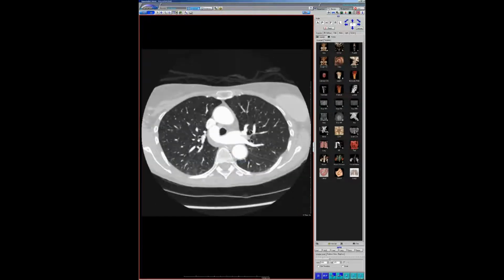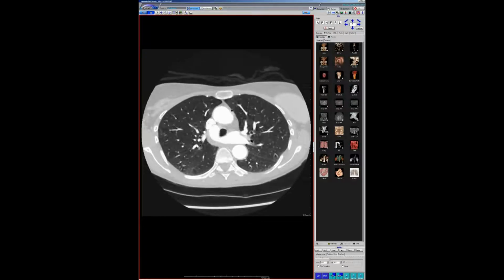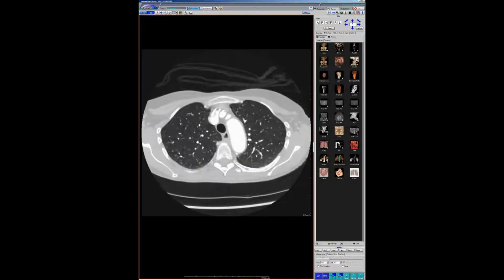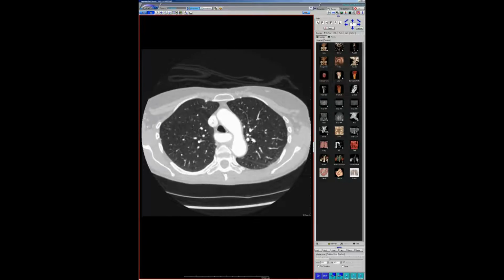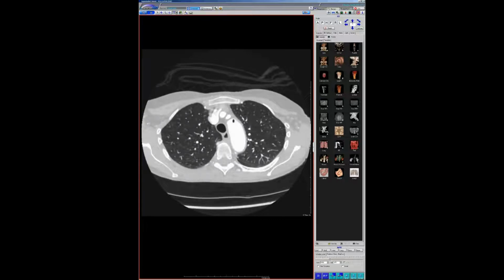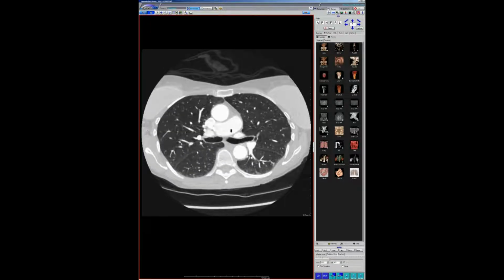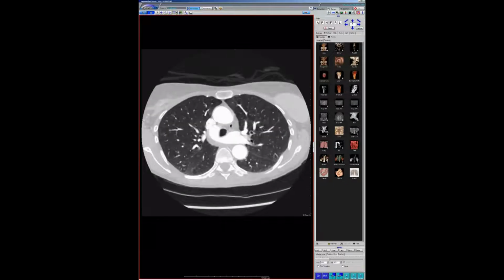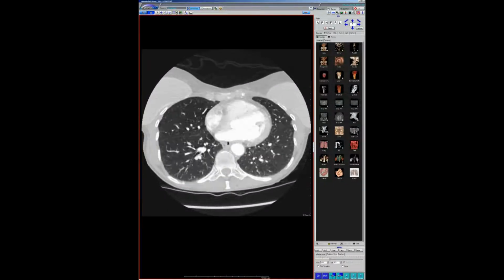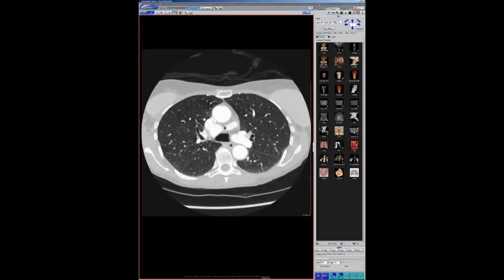Complete tracheal rings. I mean, given that it's older, probably not. But the airway definitely looks narrower. Yeah, I mean it's definitely compressed in the ring. But when you say airway, so there's right upper lobe. Well, they either get nothing, or they can get complete tracheal rings, or sometimes get a bridging bronchus, but she doesn't look like she has an anomalous lobe, like a bronchial branch.